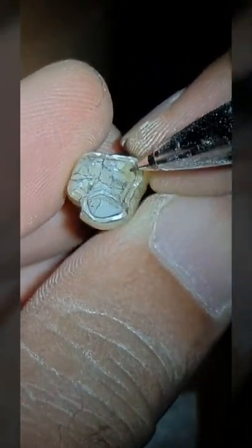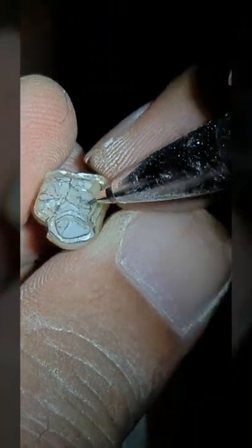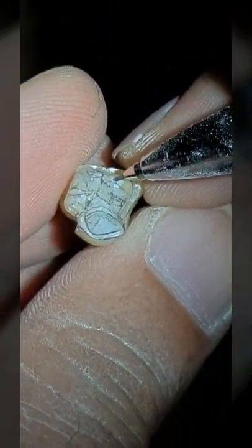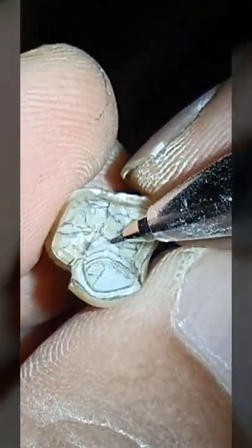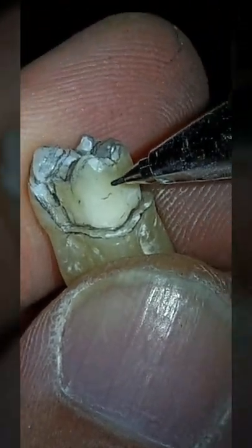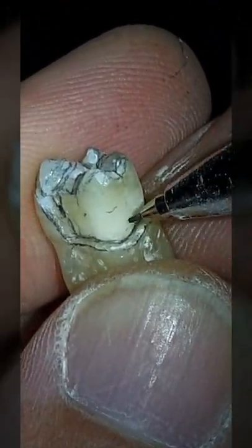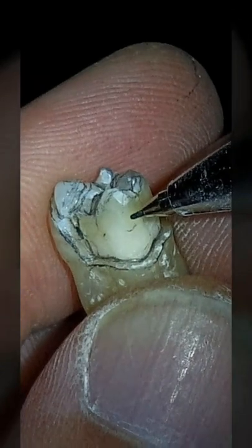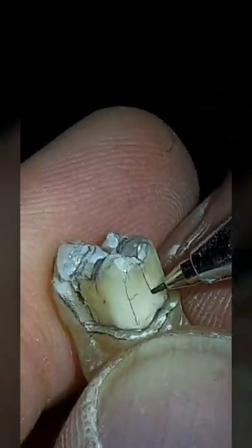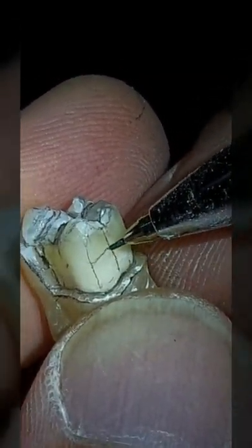And of course, in the rest of the preps, every cusp is supposed to have at least 4 facets. And in case of a functional and non-functional bevel, you add 2 more. So each cusp will end up with 6 facets. Each wall should have 2 slopes in it, the gingival curvature and the occlusal curvature. So if you look at it right here, hypothetically, you have the line angle right there, then you have the central groove. Right here, there should be 2 separate planes.